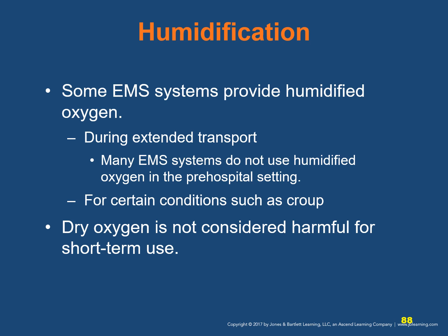Now with humidification, some EMS systems provide humidified oxygen. This is used for extended transport and for certain conditions such as croup. Dry oxygen is not considered harmful for short-term use. Many EMS systems do not use humidified oxygen in the pre-hospital setting. Refer to medical control or local protocols for guidance in involving patient treatment issues.